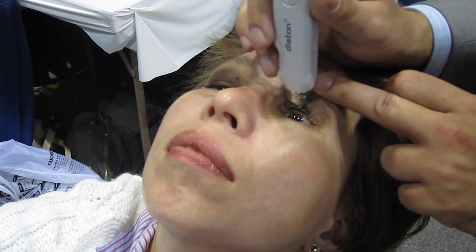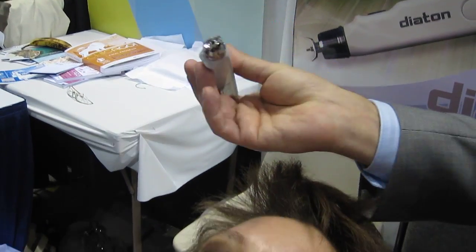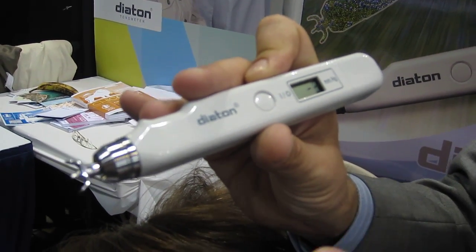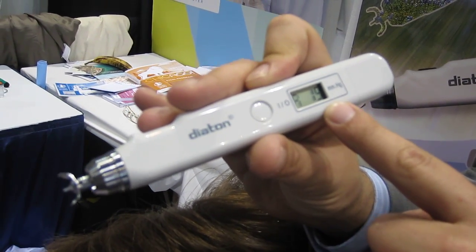Take a second reading — you would have minus two as a number of readings. Take a third reading and the device gives you a short beep once it has enough data. We took three measurements, pressed the center button, and we get the average of the readings.